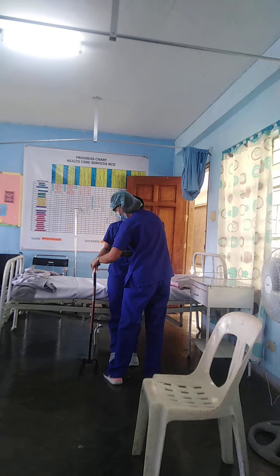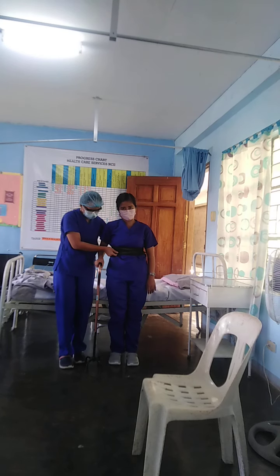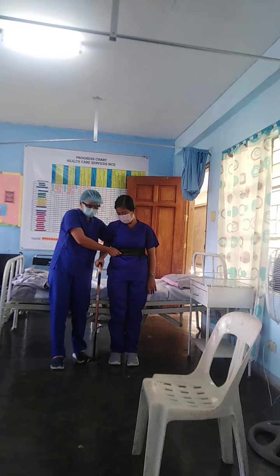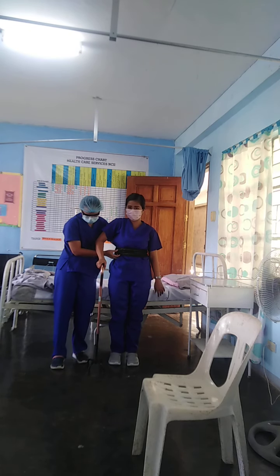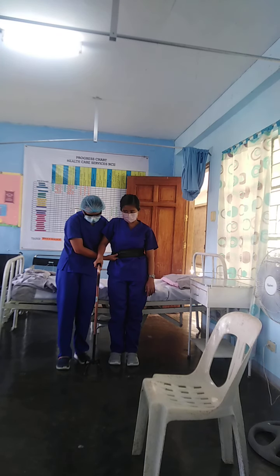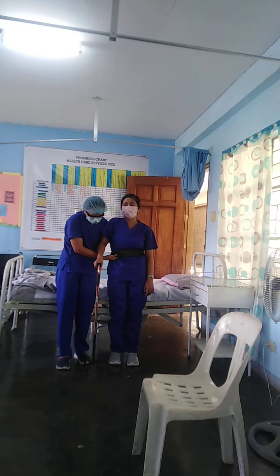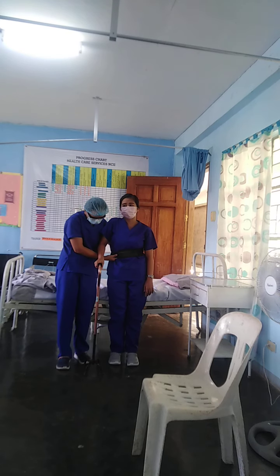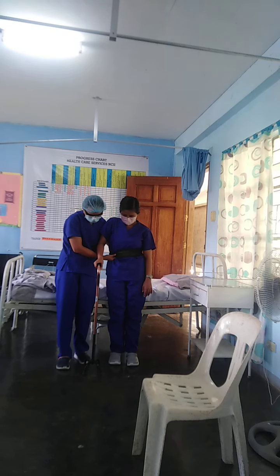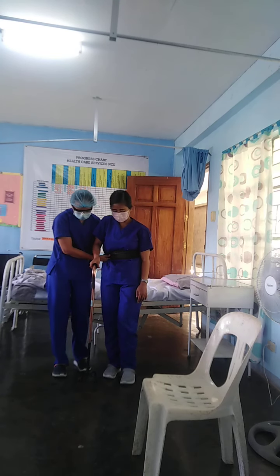Okay, ma'am. Cane and weaker leg. One, two, three. Then repeat lang po yung process. Okay, ma'am. Very good, ma'am.